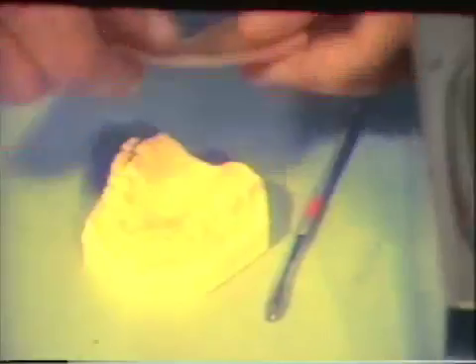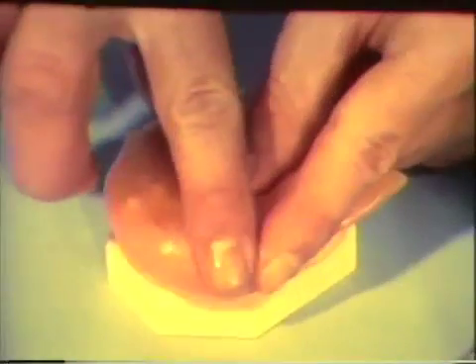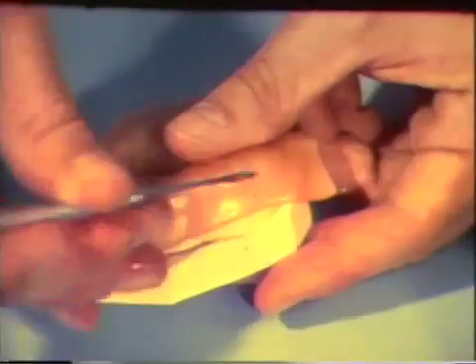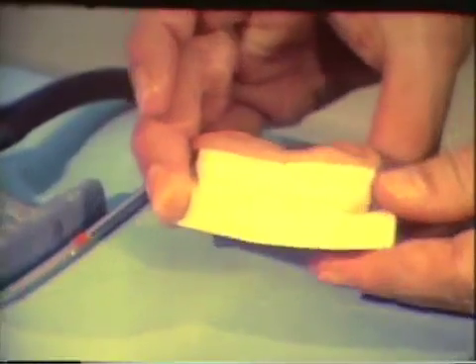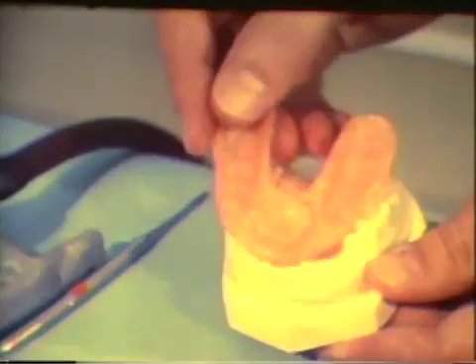The softened wax is placed on the cast. It is pressed firmly into place and molded over the teeth. The excess wax is cut away while it is still soft and can be trimmed easily. The wax has been trimmed from the buccal and palatal aspects. The pattern should extend slightly onto the buccal surface of the teeth. A perfect fit of the wax to the palatal surface is not essential.